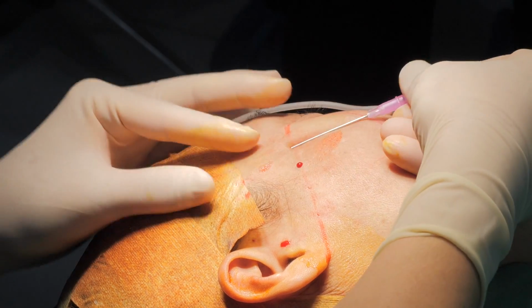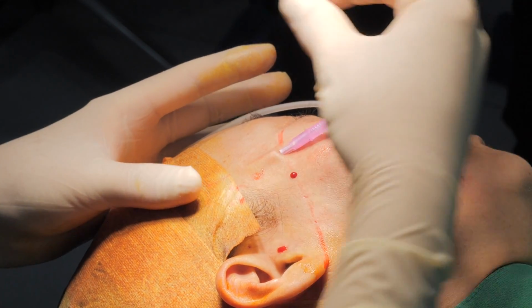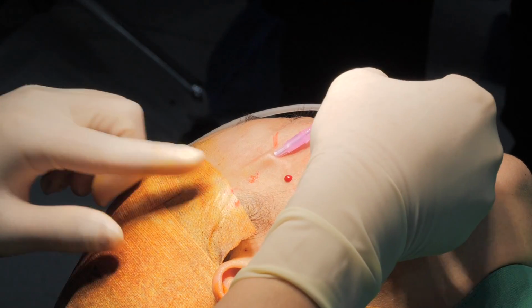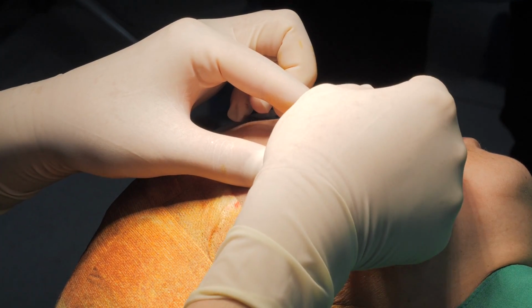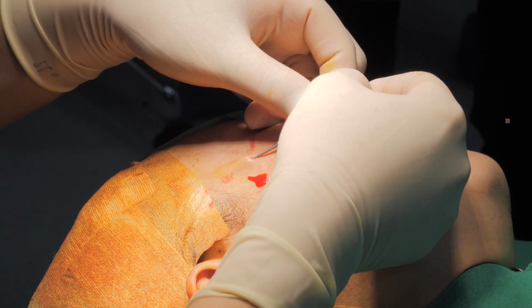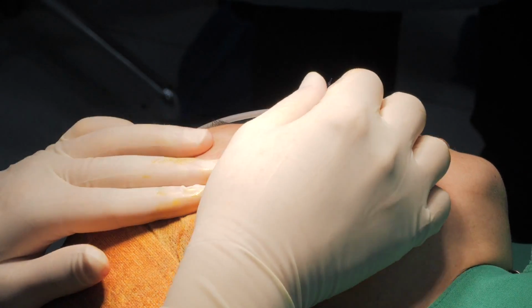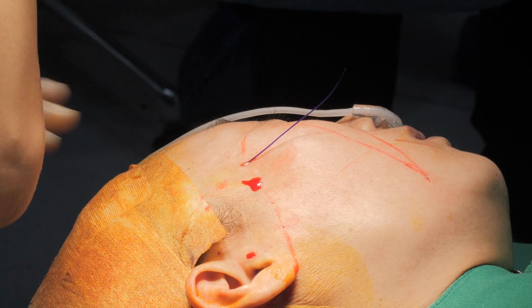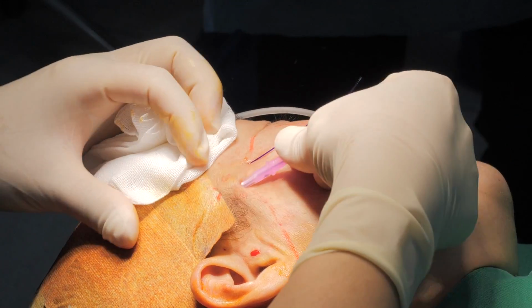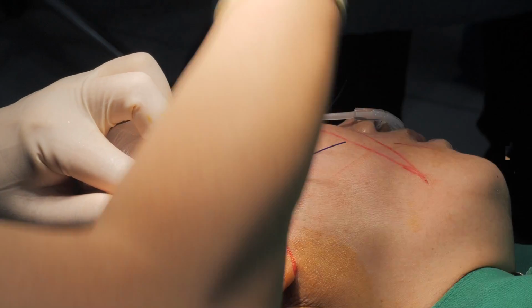I can insert the thread. So when you feel the resistance, do not advance it. Just go back and try it again. Softly. Insert the thread softly. Before removing the cannula with this thread, negative cog, the Cogmaster Gear 3/6, you should push the thread a little bit more when you start to remove the cannula. After removing the cannula, you pull the thread a little bit more to fix the cog on the tissue. Also the same. Remove this, pushing the thread again.